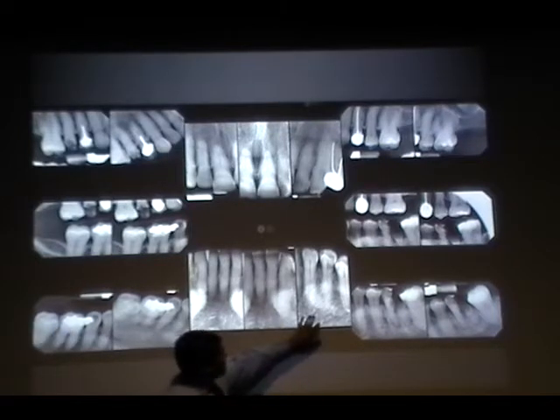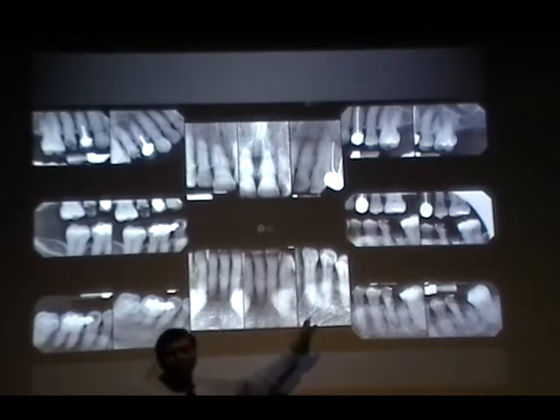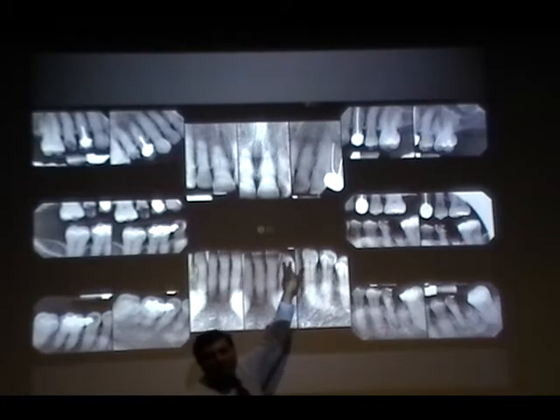Yeah. I think it has open contact, right? So we are looking at this view, right? So you are talking about open contacts, okay. In this view, what is this view called? Let me ask you that question. Not the lateral. Oh, the lateral incisor view, so that means you need to capture the lateral incisor. You see that? A smidge, part of it, right? So basically, it's posterior. So the white block should be placed between lateral incisor and canine so that you can capture this and that.